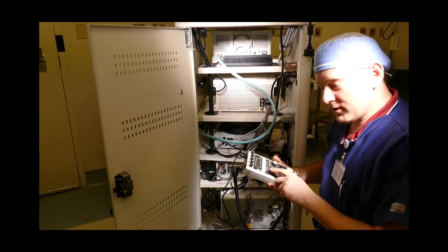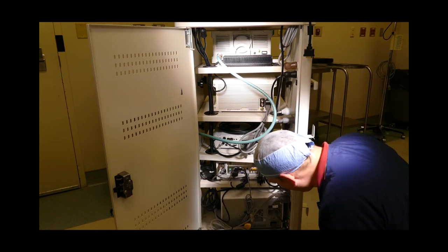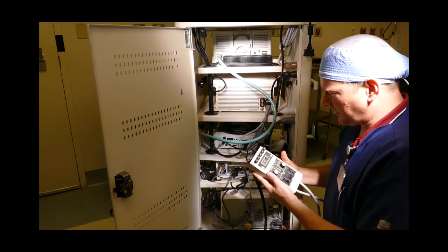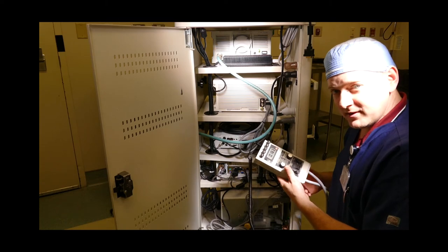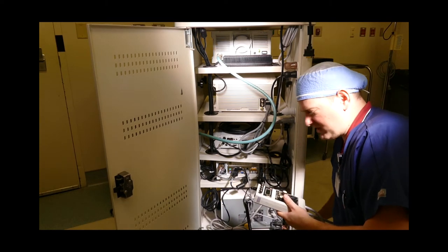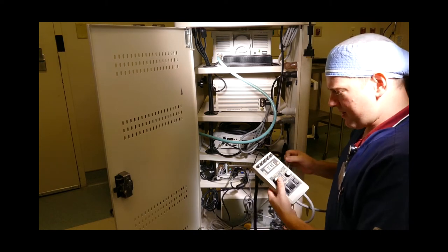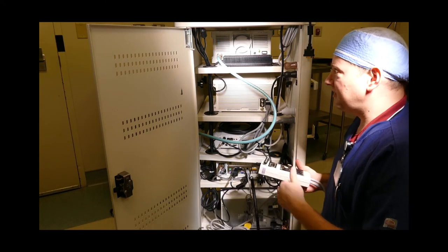The first test is going to be an earth resistance test and I'm going to test the cabinet itself. I find a good ground — it's 0.16 of an ohm, so we are good. I also have to flex the cord at both ends: at the equipment side I get 0.15 to 0.16, and at the plug side I get 0.19 to 0.25. That tests the cabinet.